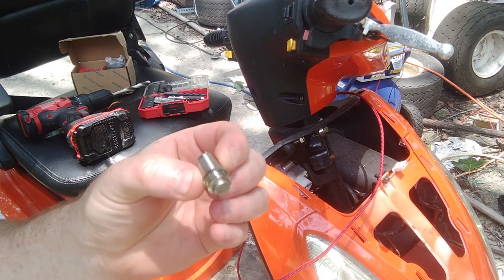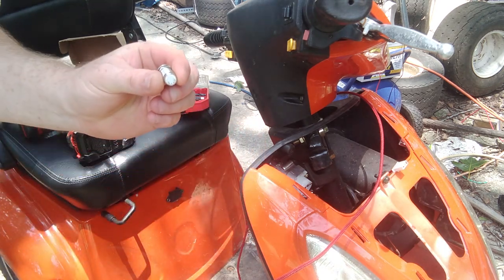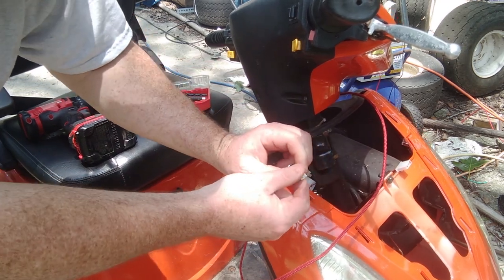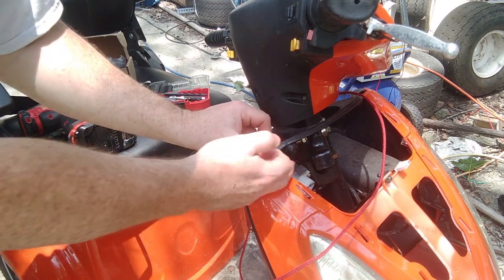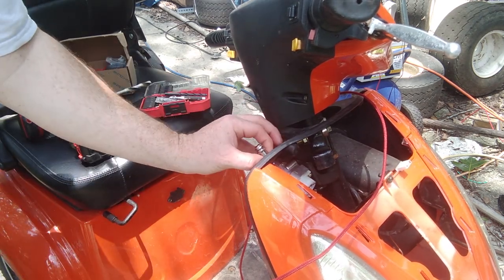Here is the push button latching switch I'm going to be installing. I wish I could solder that connector on first but I can't get it through the hole, so I'll drill this through and then solder on the connectors there. And that button is going to go right there.